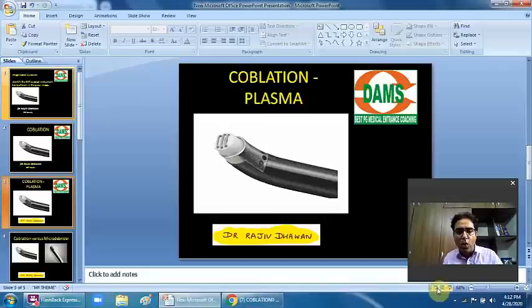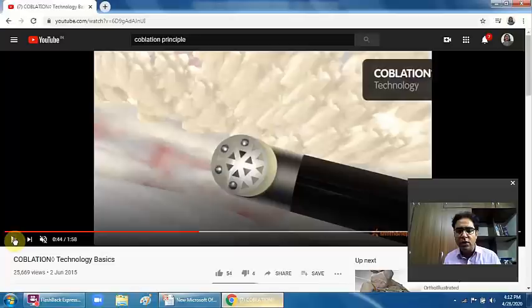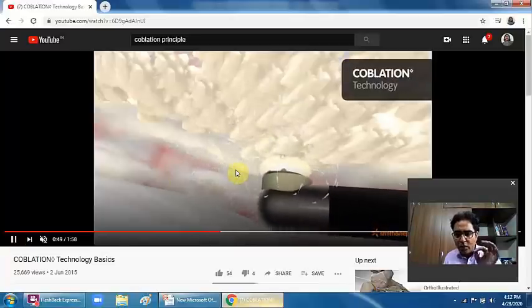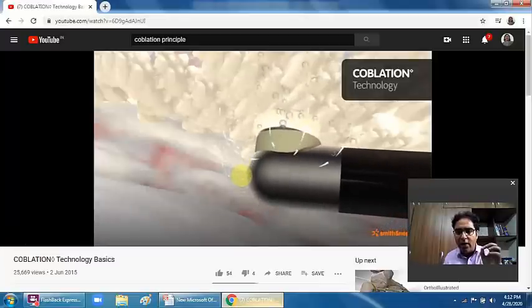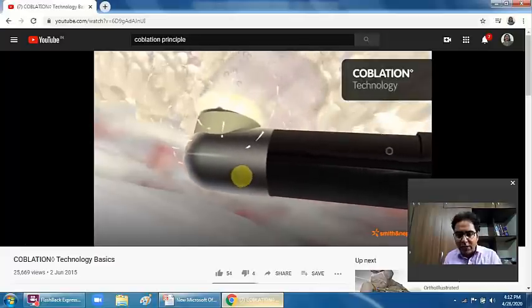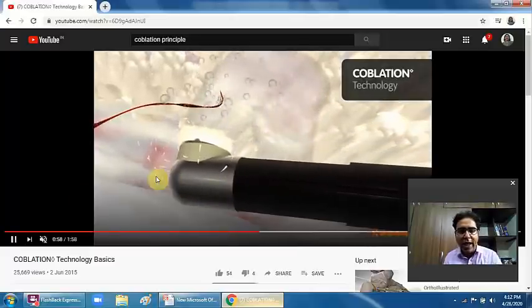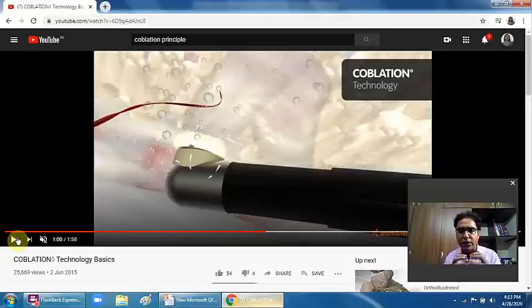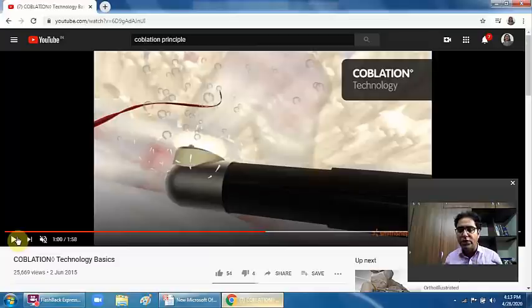Plasma means that when you are passing the radio frequency — look at this image, can you see the video — the radio frequency is being passed through the tip of this coblation wand, and this energy passing through the normal cell line gives you the energy to evaporate the cells, because this energy will break the bonds between the molecules of the cell and the cell will get evaporated. So this controlled ablation will not cause depth damage — you will remove it layer-wise.